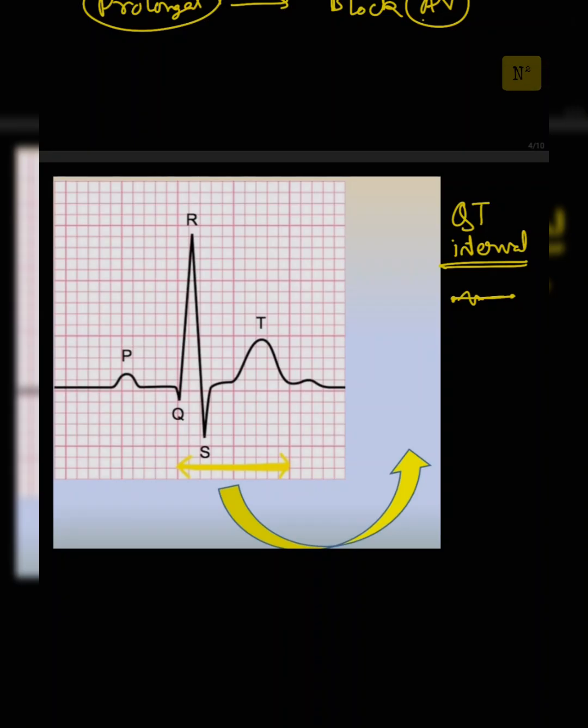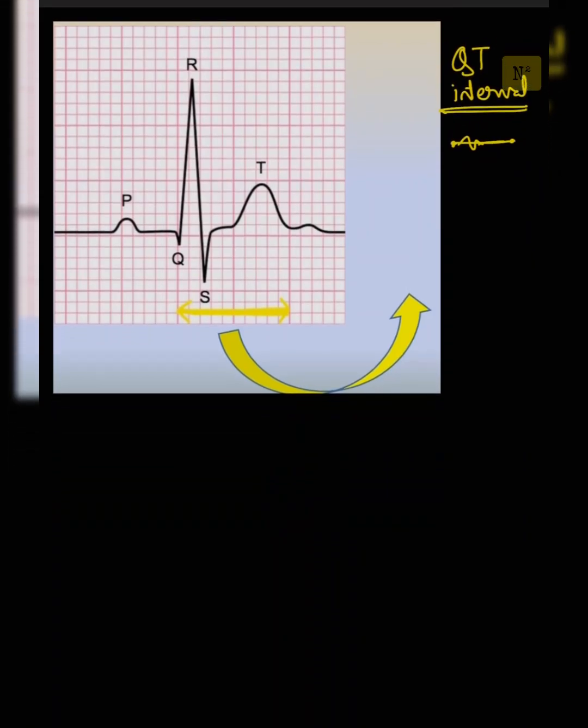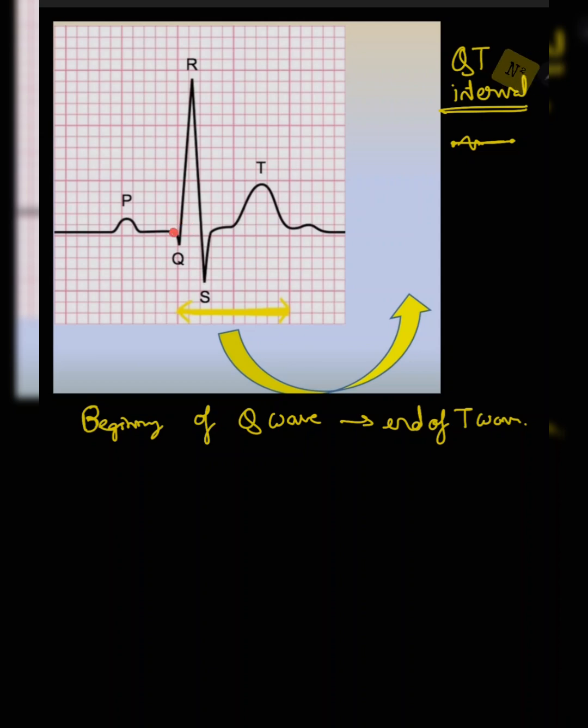It shows the interval from the beginning of the Q wave to the end of the T wave.